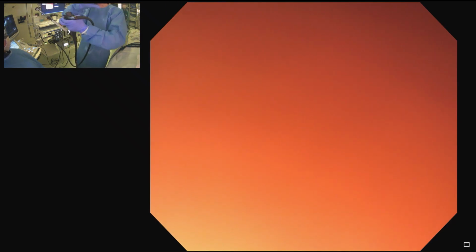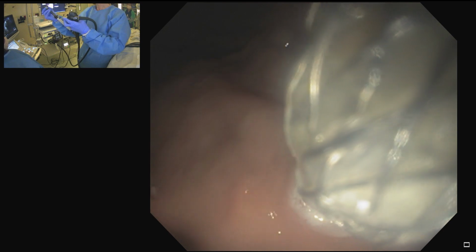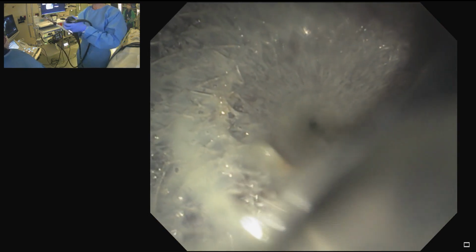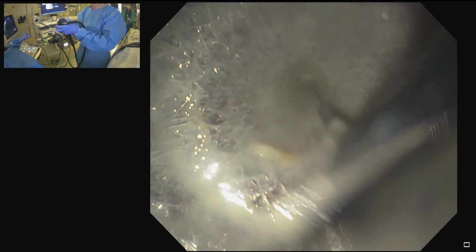All right, now you can see it's red out now because I'm really right up against the wall. But what I'm going to do with my body is I'm going to slowly turn to the right while I give gas, while I push out this flange. There we go. Nice. You're going to see the flange open up, and there it is. Now the cottage cheese is already trying to get out. You can see this is thick pus.